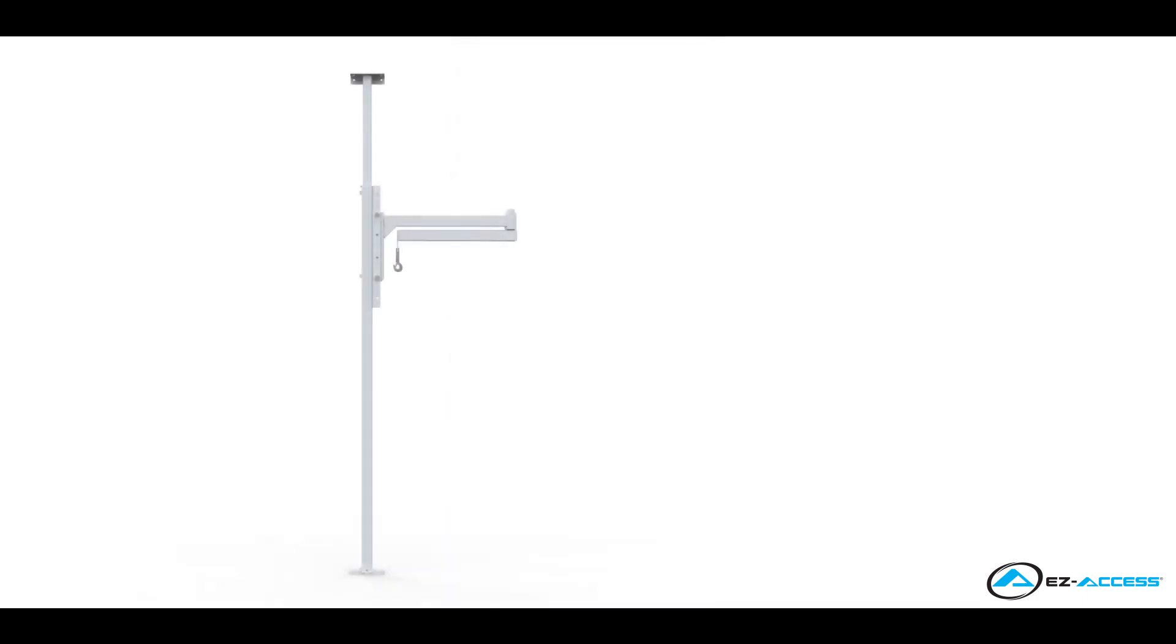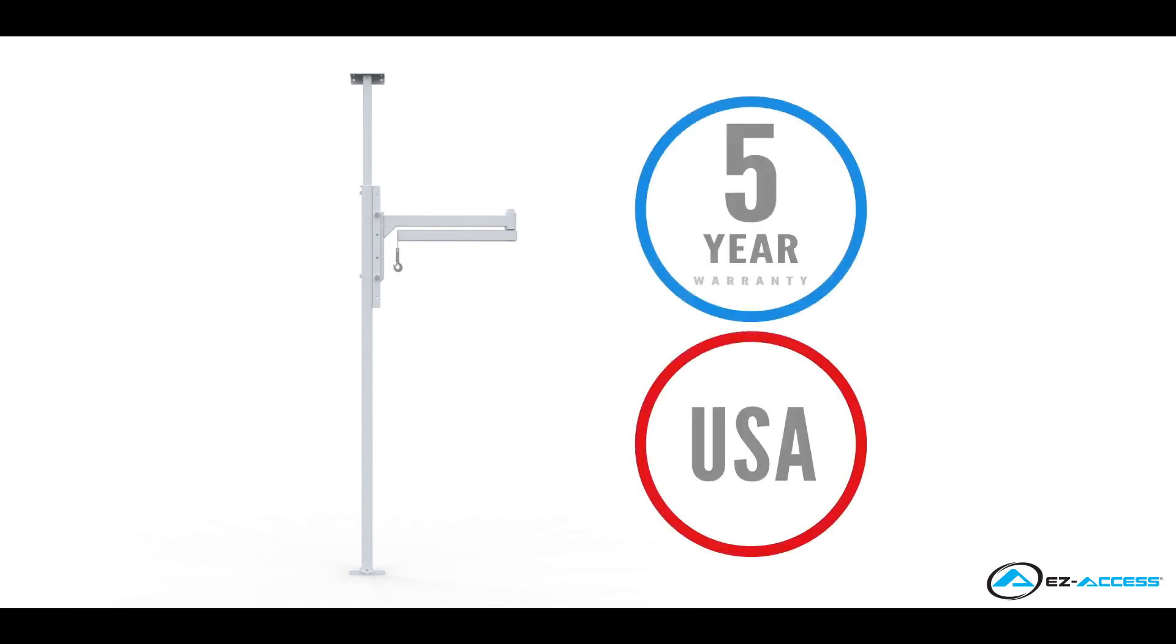The unit is made of steel and is powder-coated white. The Orbit Patient Transfer Lift features our easy-access 5-year warranty and is manufactured in the USA.